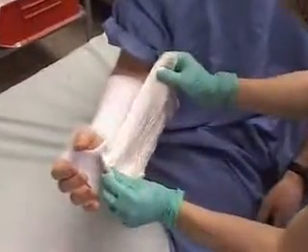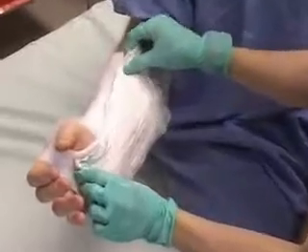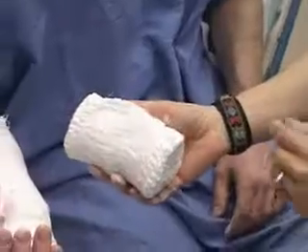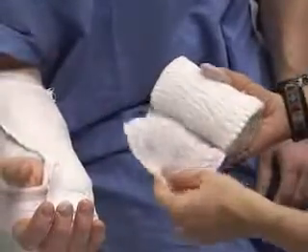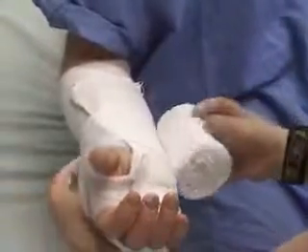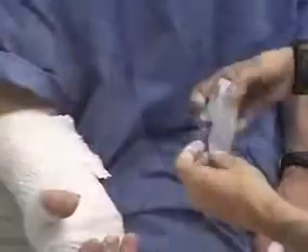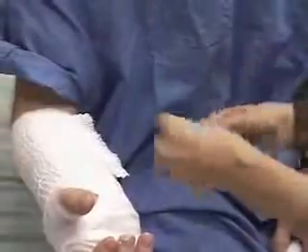The plaster generates heat. This exothermic reaction means rapid drying and setting. We cover the slab with the gauze roll, again unrolling without tension or pressure, and a little tape to hold the gauze in place.